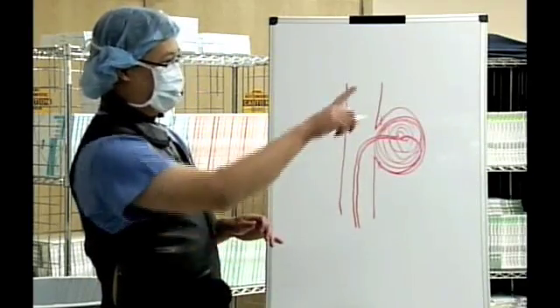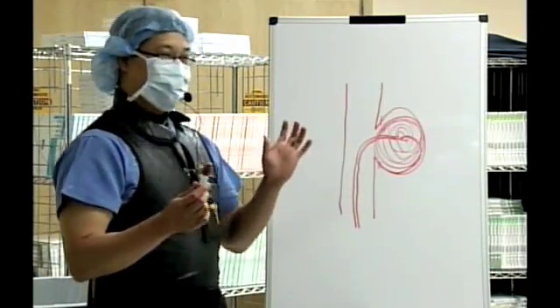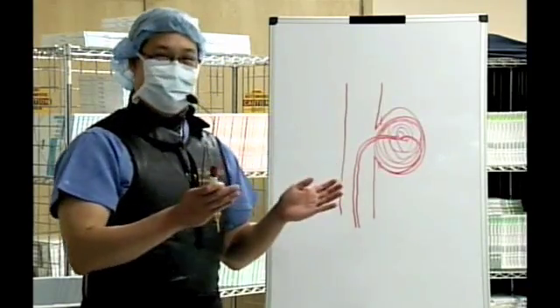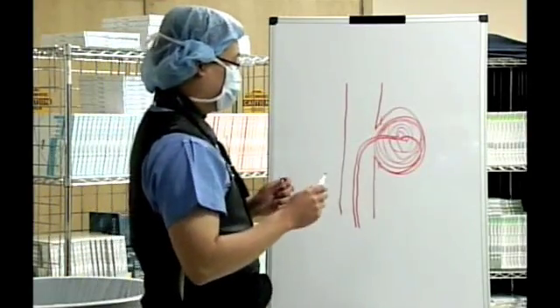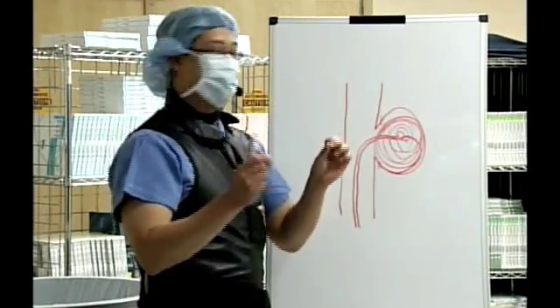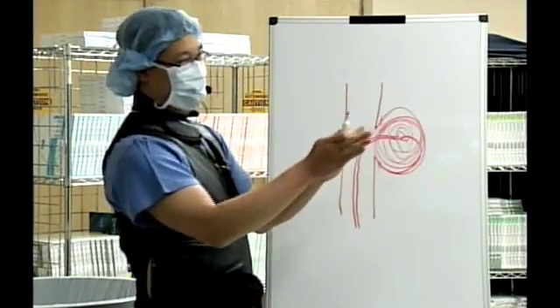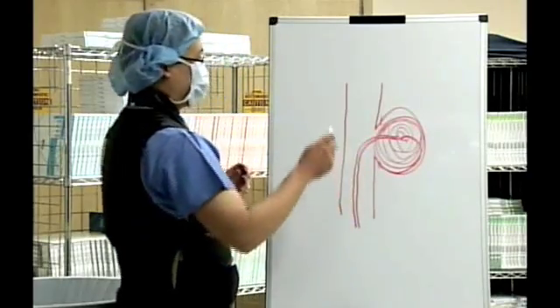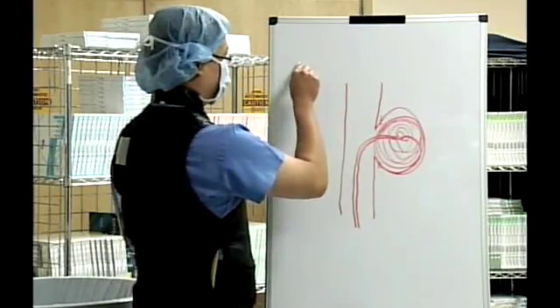A few things that you might see on the X-ray, because basically, when you're looking through X-ray, you obviously can't see inside the patient's head. We have to look at various things. We're basically looking for dots that are on the catheters. This is actually important, or else you'll look at the images that we're about to show you, and you'll be like, what are they doing? But basically, there are a few markers that are important to notice.